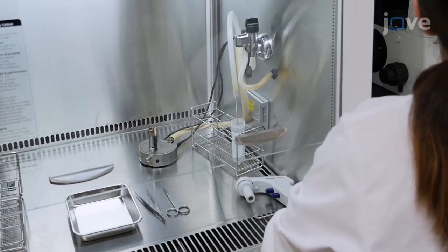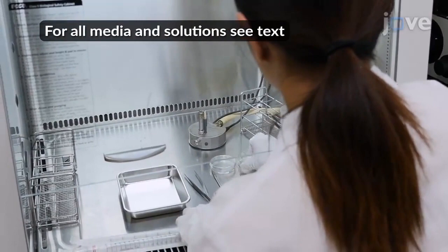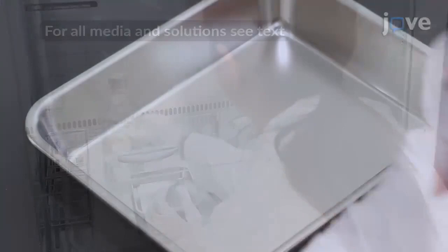To begin dissecting the umbilical cord, first prepare a metal tray, sterilized scissors and forceps, 10-milliliter pipettes, 25-milliliter pipettes, and two 60-millimeter tissue culture dishes. Warm up PBS, Purified Enzyme Blends, a 500-milliliter bottle of reduced serum medium, and culture medium to room temperature.